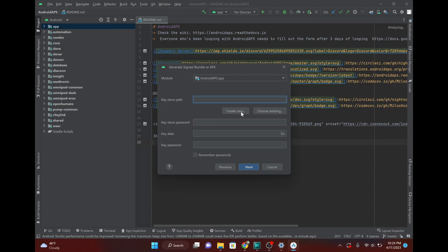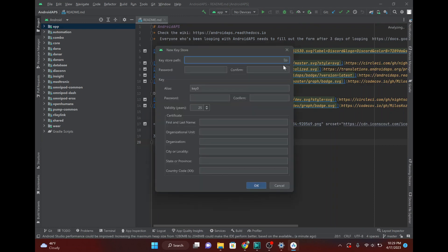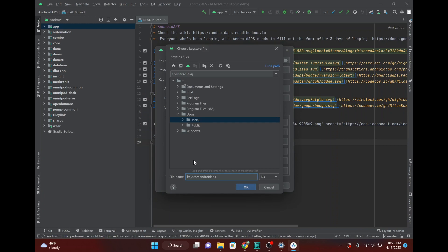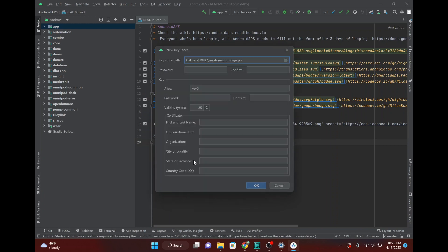You do have to create a Keystore path. You can save that anywhere. I just save it right there. Keystore, Android, APS. You can call it whatever you want. So, you do have to create a password. In the two years that I've used Android APS, never once have I had to actually go back and use that. But hypothetically, you could. So, just make sure that it is something that you will remember if you need to.